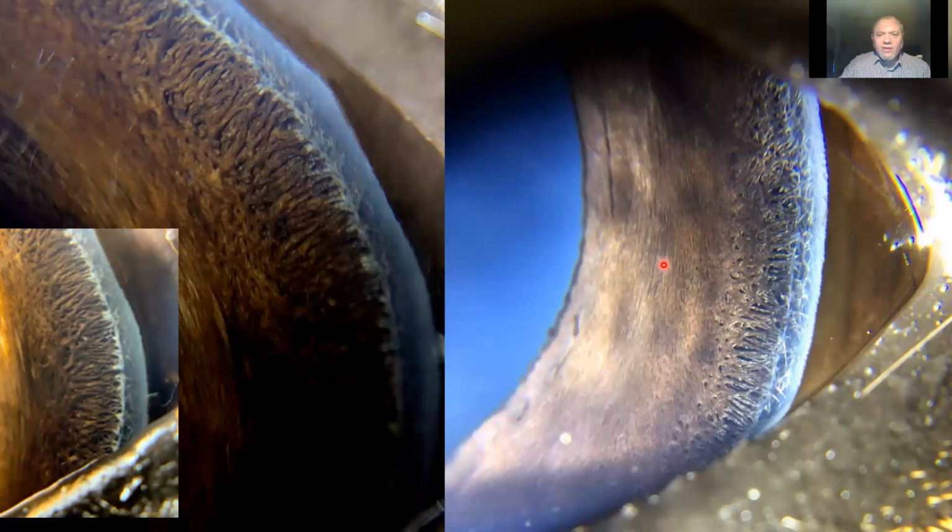So again, we have the edge of the pupil, the iris itself, the pupil zone, the ciliary zone, and then the insertions of these beautiful pectinate ligaments going up to the inside of the cornea, and then you can see through the cornea, through the grey line, actually into the drainage angle itself. The way we photograph these is by using the macro lens and having an oblique light coming in to highlight the pectinate ligaments.